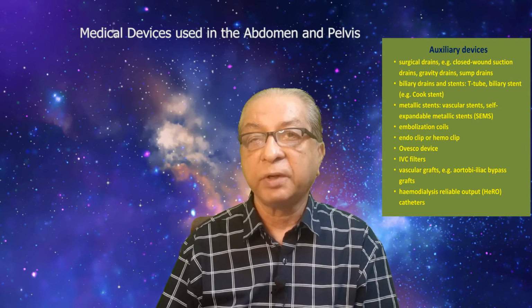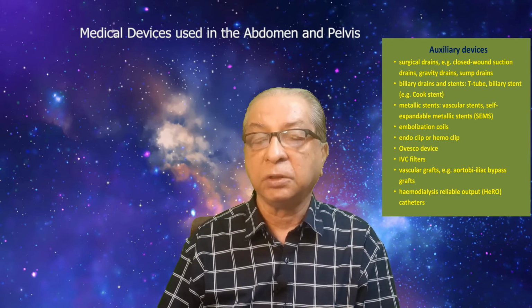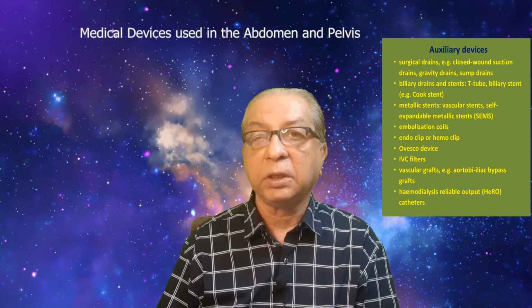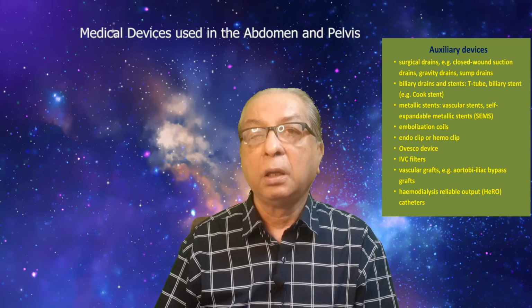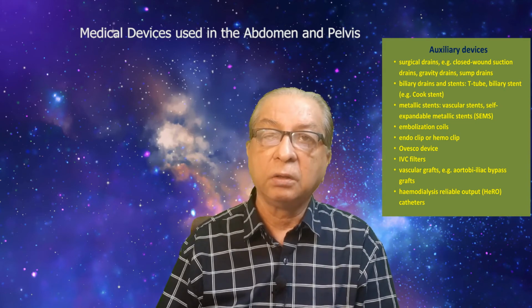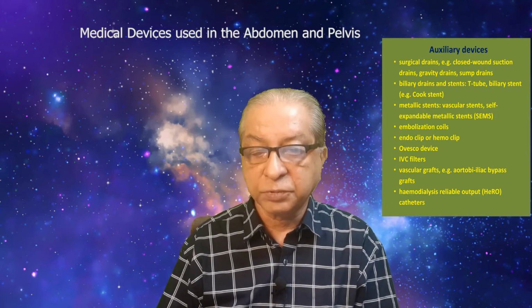So migration is a very important point, and do not get upset when something is not seen, because a doctor will be able to locate it very naturally and safely. Do not search for it yourself, or get upset mentally.